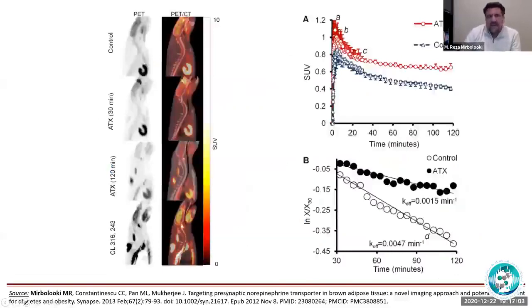Then I also did some imaging on non-fasted animals. One of the very common problems that scientists have working with F18-FDG is that the blood glucose level can change the way that F18-FDG is absorbed in the target organ, because this is all based on competition.